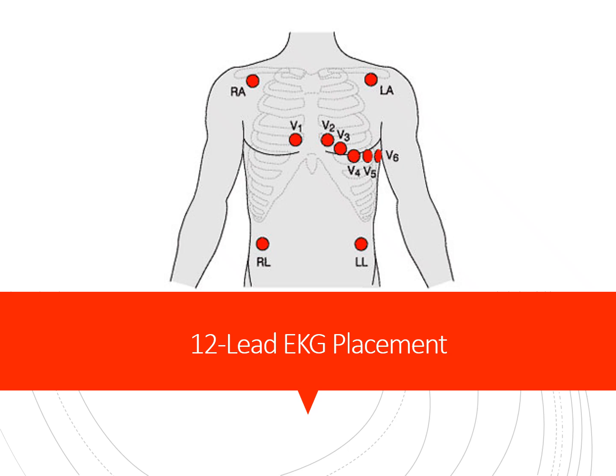For the limb leads, we place the right arm and the left arm electrodes on the upper arms or shoulders, and the right leg and the left leg on the lower torso. These create the standard limb leads, which are 1, 2, 3, and the augmented leads aVR, aVL, and aVF. They give us the frontal view of the cardiac activity.